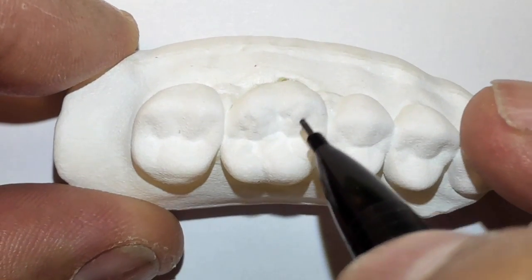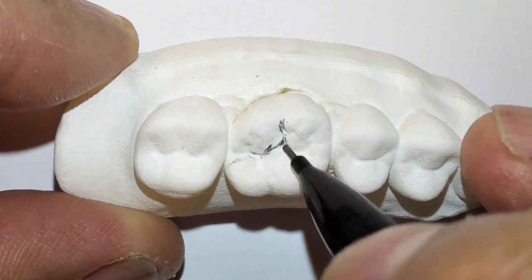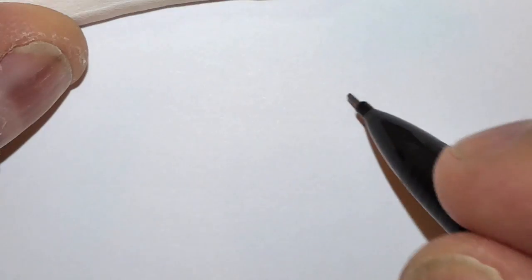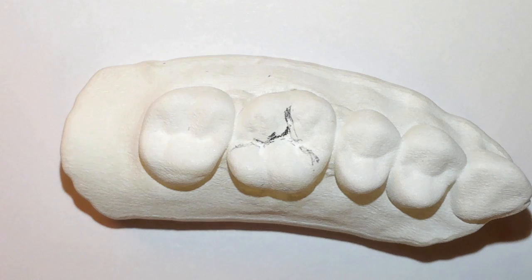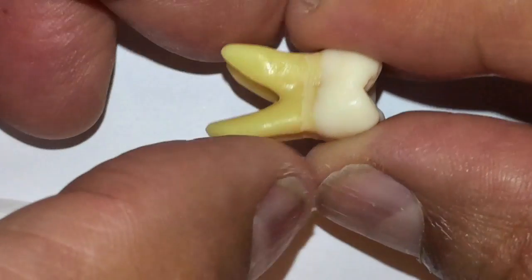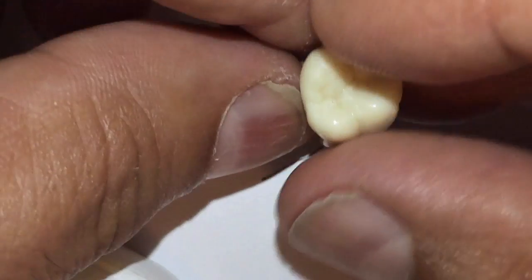This is tooth number three, a first permanent molar, and I'm going to go ahead and outline that now — kind of give us an idea where our cut's going to be. So we've talked about this in earlier lectures; it's almost like the peace sign. The roots are trifurcated actually, and if I were to show you a quick molar here, the tooth is not only trifurcated but the roots have different curvatures and contours. Some are flat, some are conical, and so there's a definite sequence of removing the root tips.